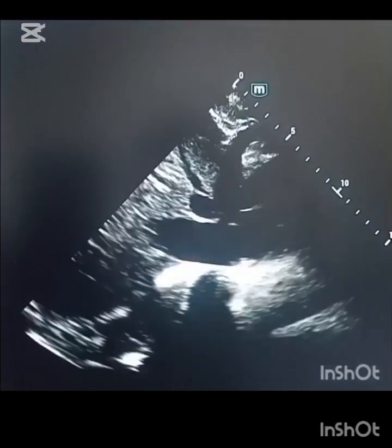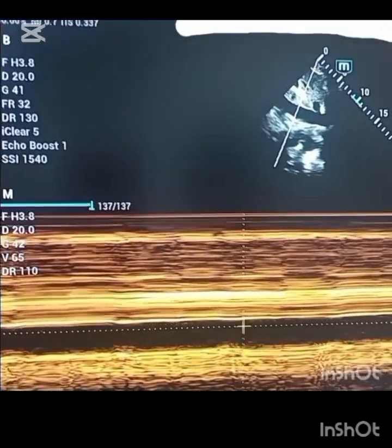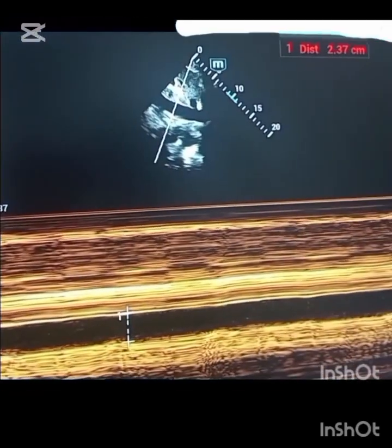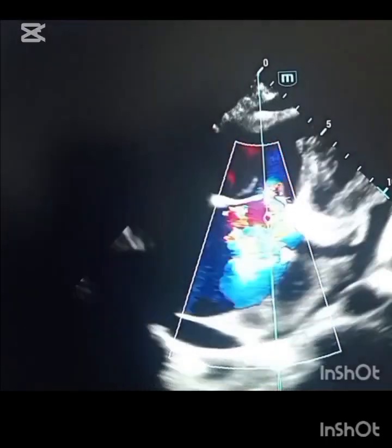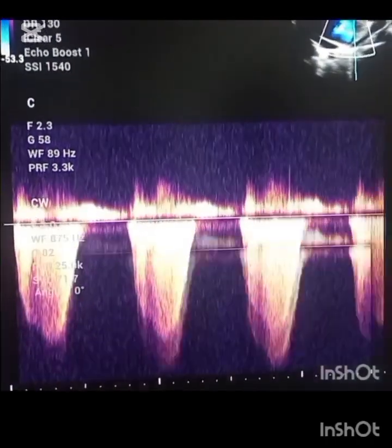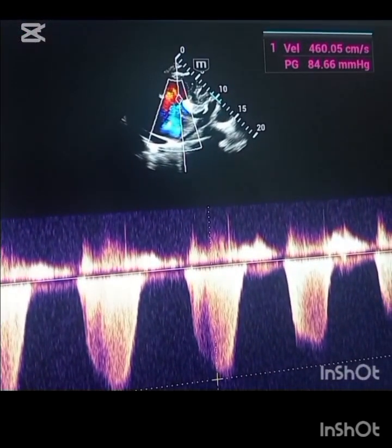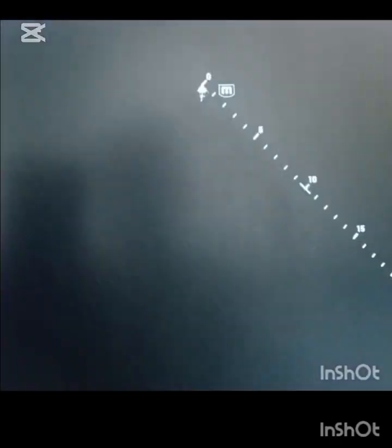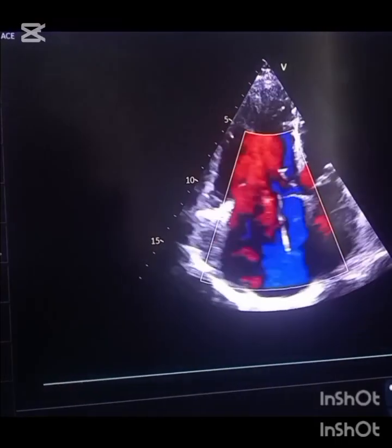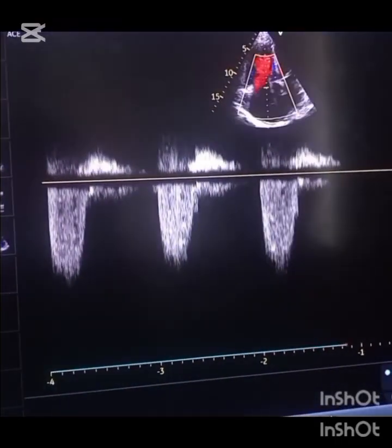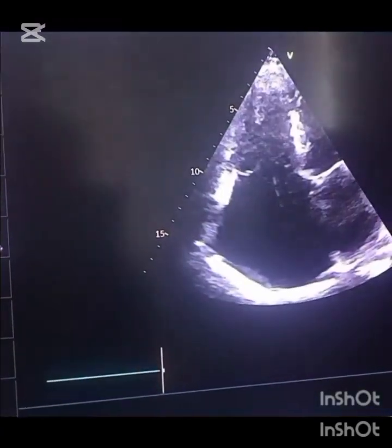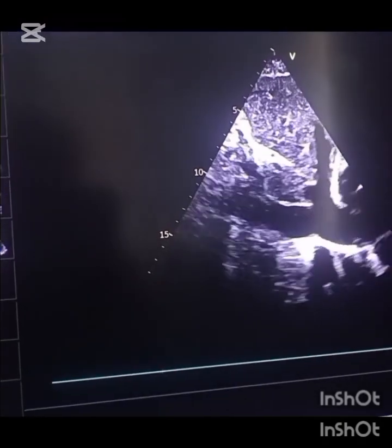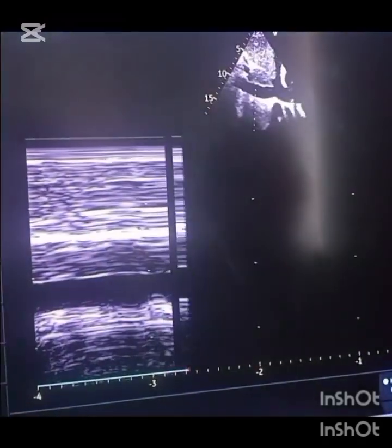So the RVSP method: obtain the TR gradient, then add the right atrial pressure based on IVC assessment. When the IVC is dilated and non-collapsing, right atrial pressure is 15 mmHg. It is important to note that severe TR does not necessarily mean a very high gradient. Sometimes TR is mild but the gradient is very high; other times TR is severe but the gradient is low, because RV dysfunction reduces generated pressure.